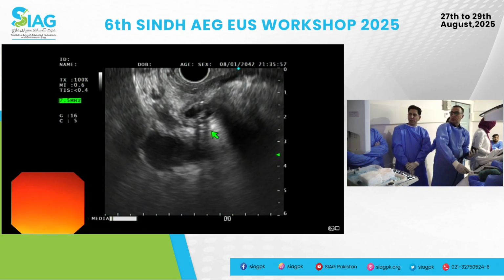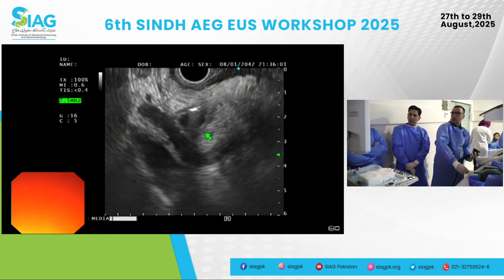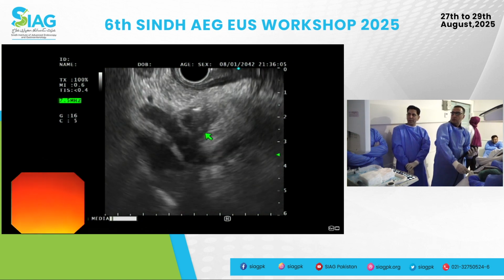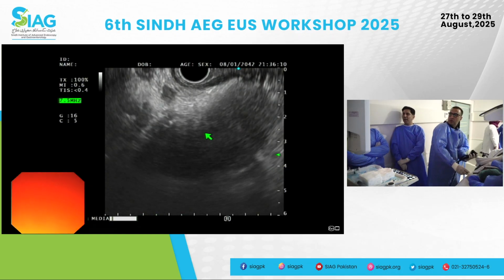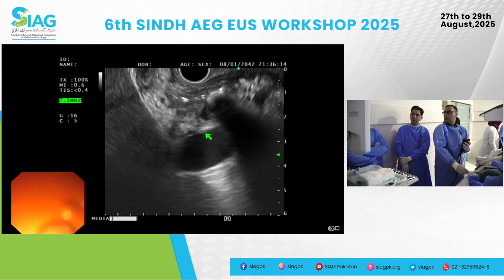Anti-clockwise, anti-clockwise, anti-clockwise. Go all the way, so follow the cystic duct and go toward the gallbladder. Very nice, very nice, very nice. So, and then do you want to just show us the distal CBD where there was a suspicion of the stricture?